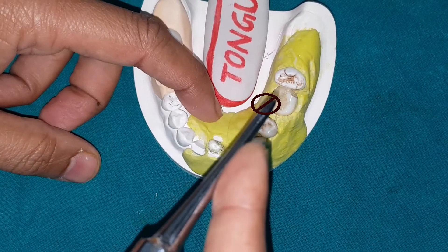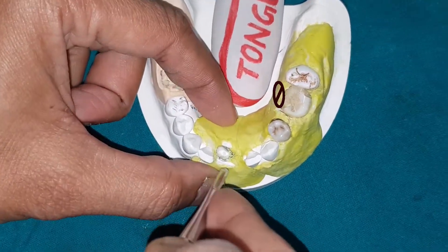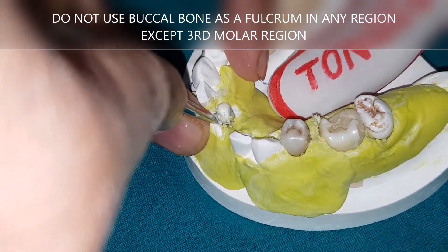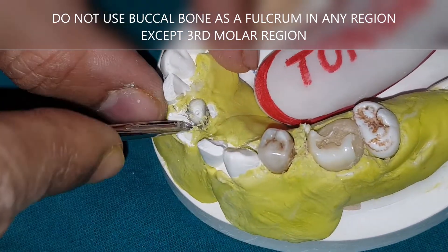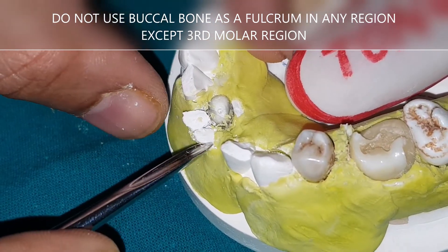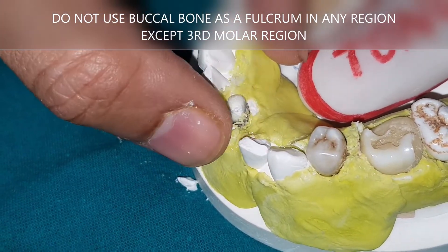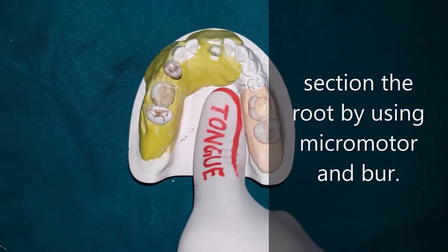For example, if a root tip is fractured at the level of the bone and you want to remove it with the straight elevator, never apply force directly buccally — the buccal bone will fracture. If you want to preserve the buccal bone, section the root first and then use the straight elevator to remove each sectioned piece.